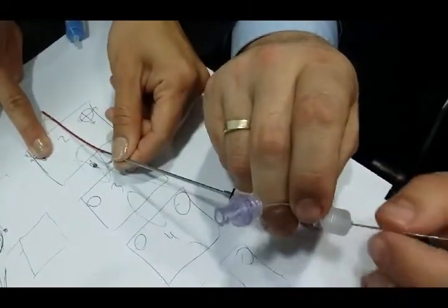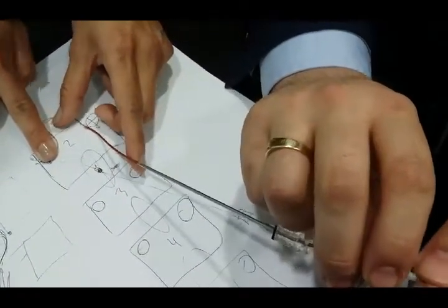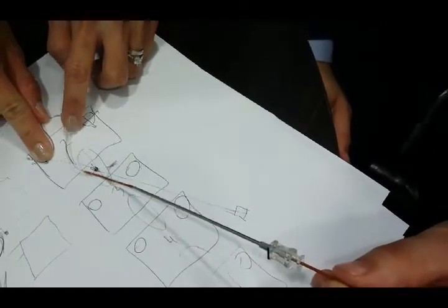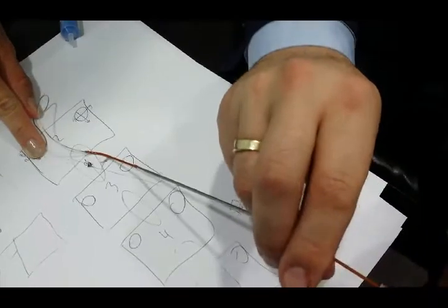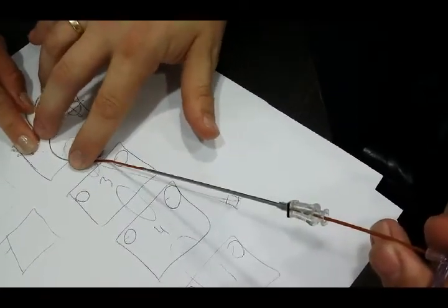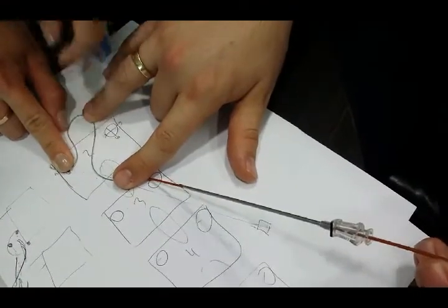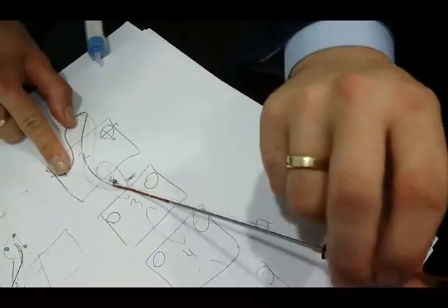Lock it, unlock it, and pull the sheath back below the pedicle. Then advance the lead a little bit more for redundancy - we don't need too much. We don't want it to cross at all. We want it to have this nice upward loop and an S-curve like that - it just needs to really be touching the pedicle to get that binding. Nice S-curve, and you don't want them to cross over and twist. Then you pull the sheath out over the lead.